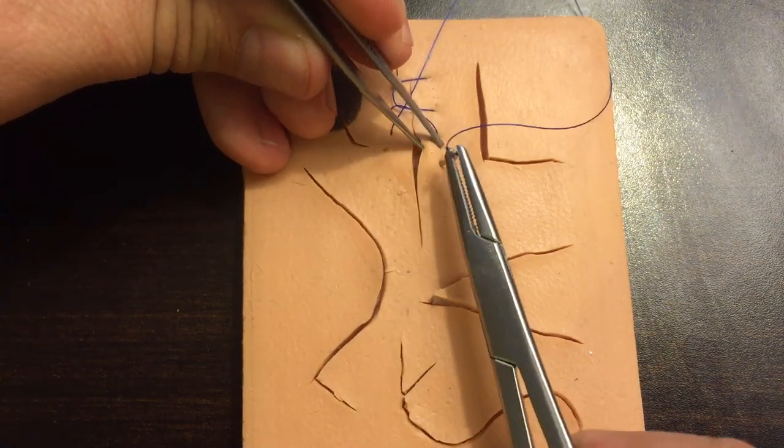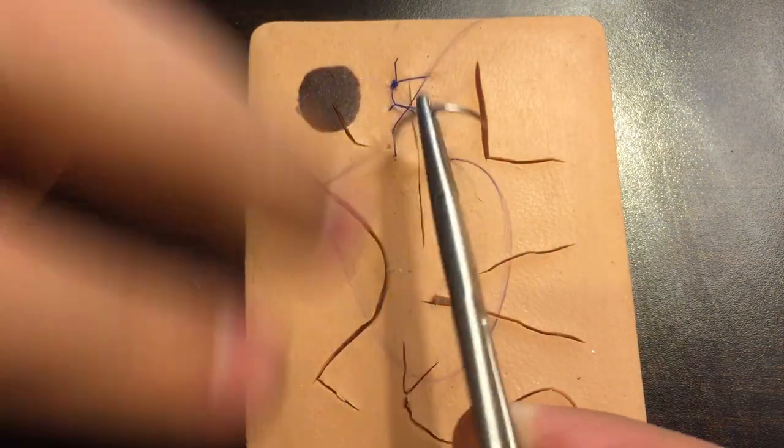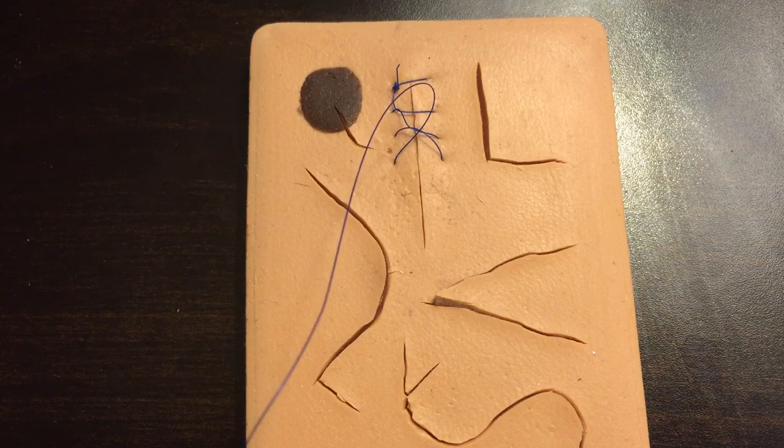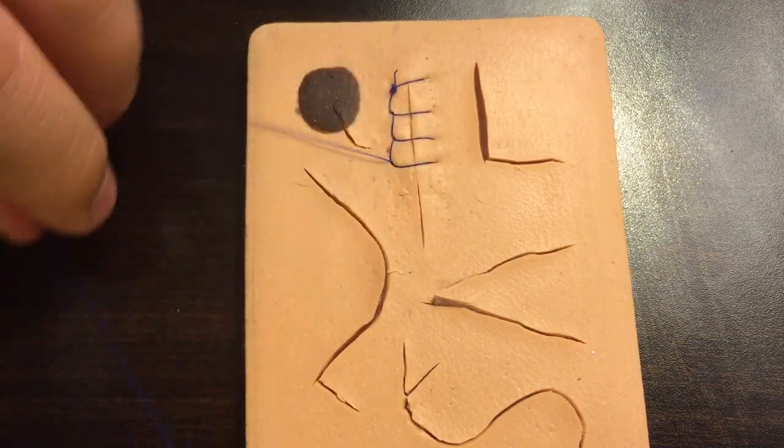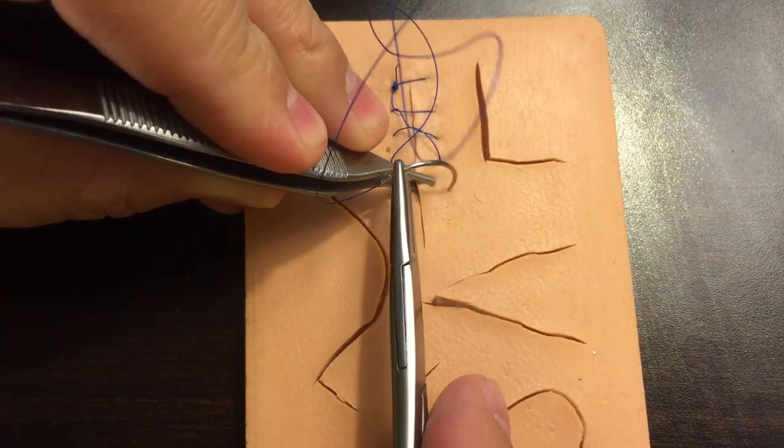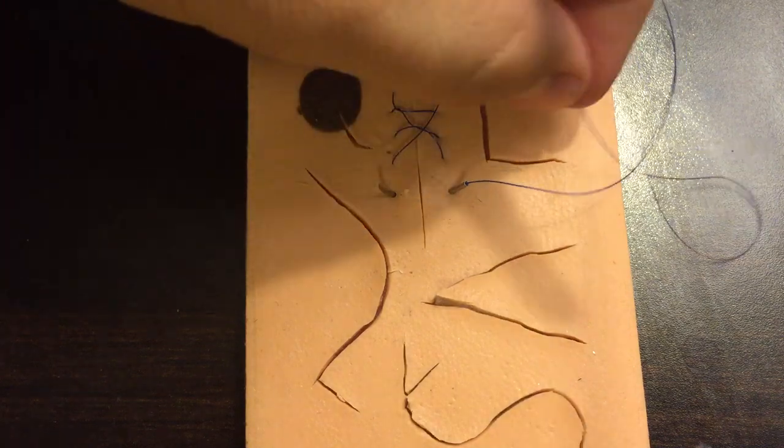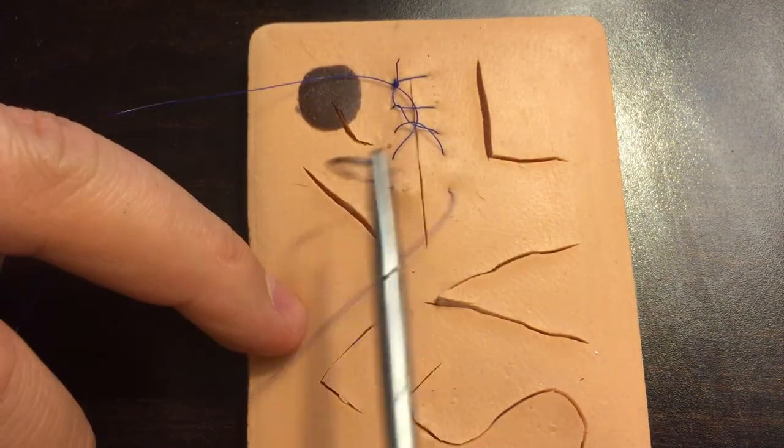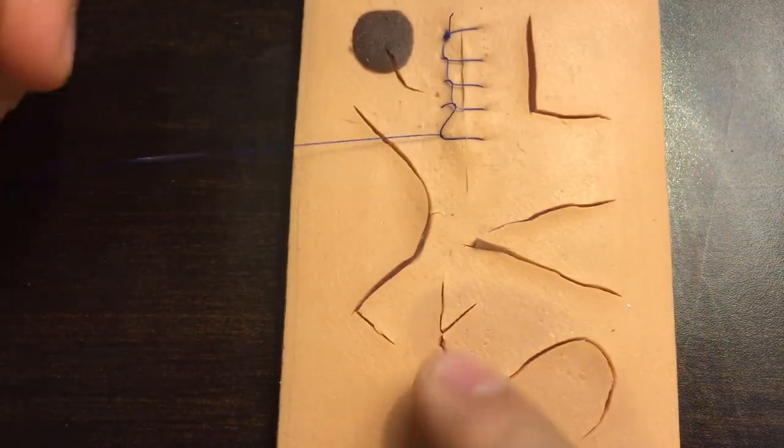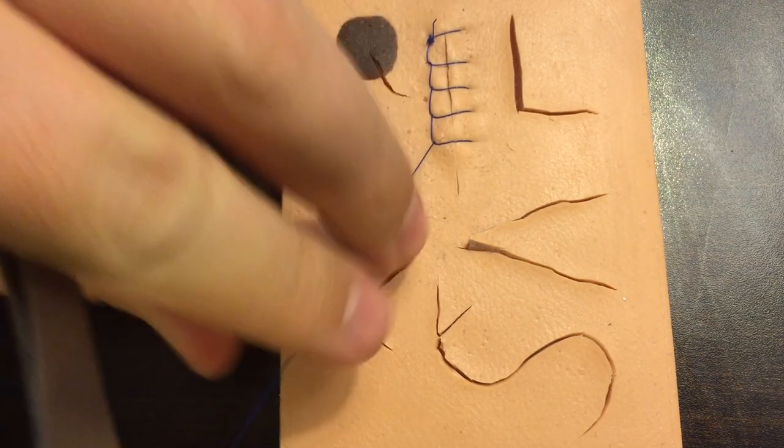So again, 90 degrees for our simple interrupted coming out at 90 degrees, and then we're going to make sure that we're pulling it up through a loop so that it does the locking. Now with the next one, we'll pretend that we're at the end of that laceration. And I'll show you how you end and tie this type of a suture. So one more throw. And we're going to come up through. Oh, I forgot to show you, we're going to have to do one more. So there we go. One more then. We'll show you how it's tied then.